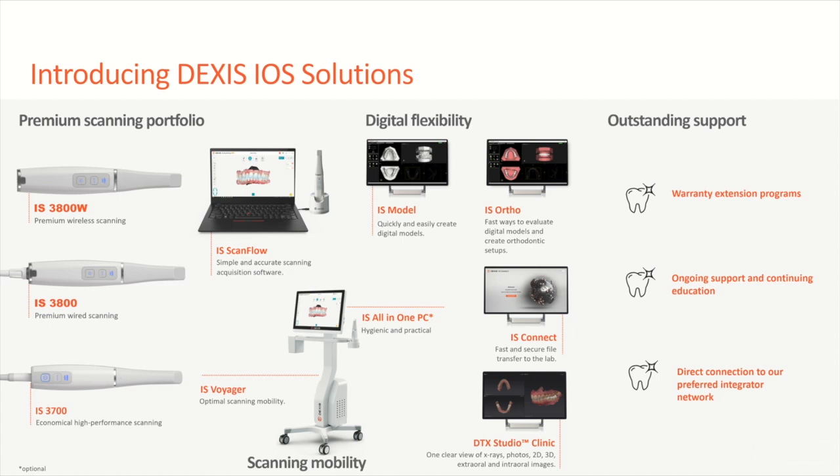In case of software, we provide IS ScanFlow, which is acquisition software with many AI-driven functions that help during the scanning process, and a few workflows that are helpful in case of scanning more complex cases, such as implants, dentures, and so on. Regarding software, we also offer additional ones, IS Model and IS Ortho, which I will show you later today.